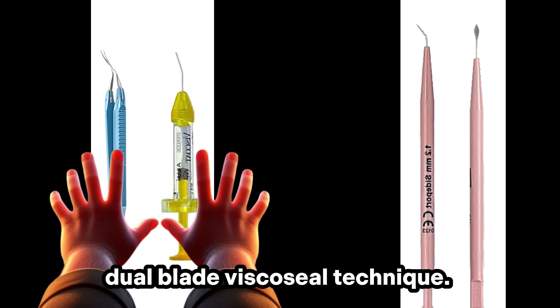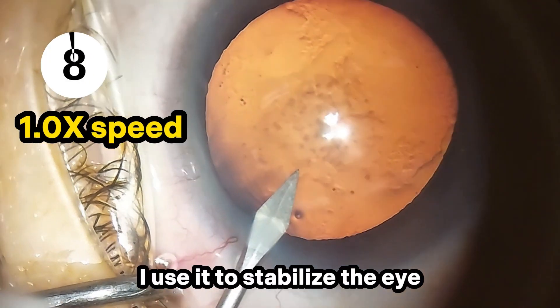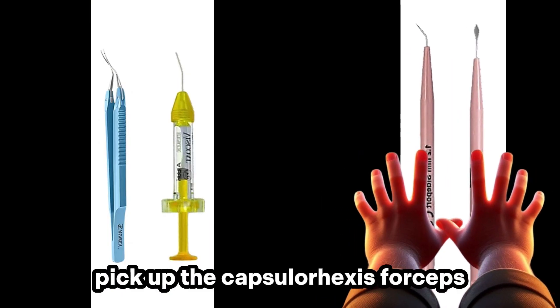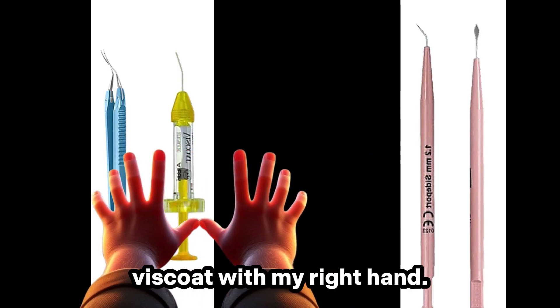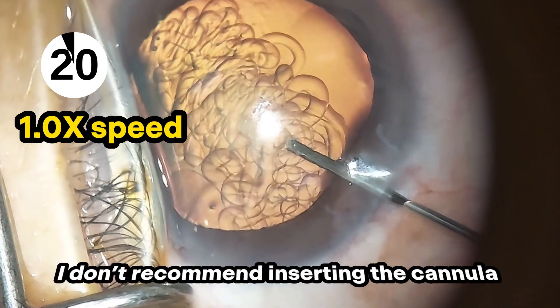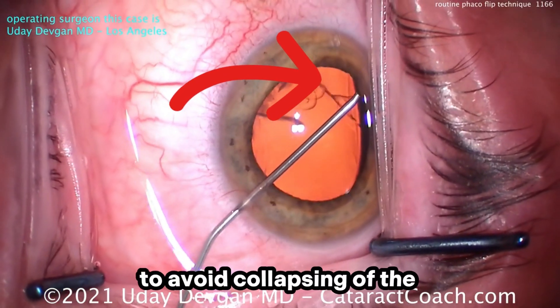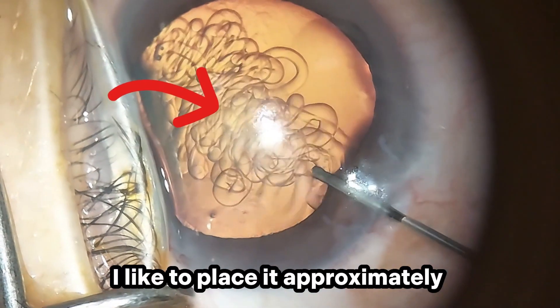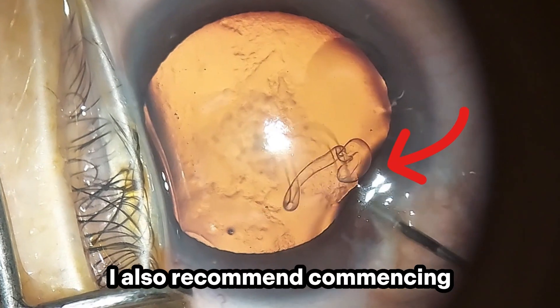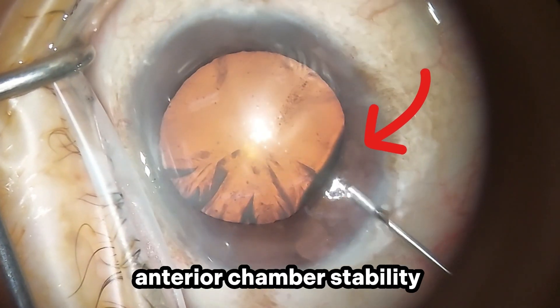Here I'll walk through my dual blade viscoseal technique. I grab both instruments, first create the side port incision, and while the side port knife is still in the anterior chamber, I use it to stabilize the eye and create the main incision with my keratome. Note that the angle of the two blades is different. Next, I drop both instruments and pick up the capsulorrhexis forceps with my left hand and viscoat with my right hand. I perform the visco seal technique by applying viscoelastic material over the main incision before entering the anterior chamber. I recommend placing the cannula approximately at the center of the anterior chamber, where there's maximum distance between the endothelium and the anterior capsule, and commencing viscoelastic injection right away.